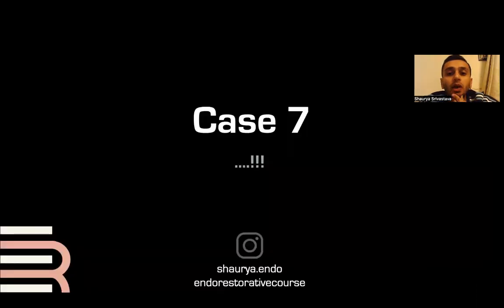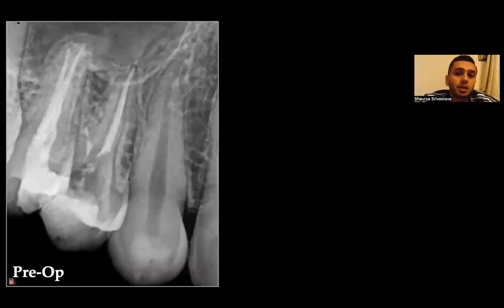Okay, so case 7. This was another case, an internal referral. It was an upper right 4, a premolar, initially treated by a specialist, and the patient's symptoms still persisted. So they tried to re-intervene, and then said, okay, we're just going to refer the patient. They sent it over to me with the history, everything, and the patient had sharp pain on biting. Endo was done over 2 or 3 visits, but the symptoms were persistent.